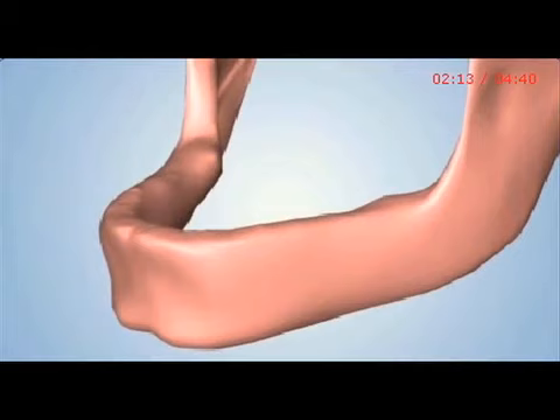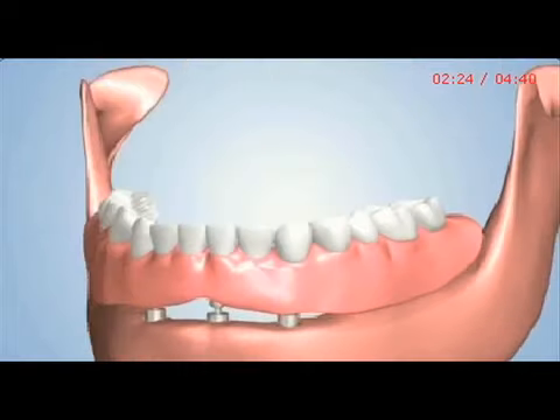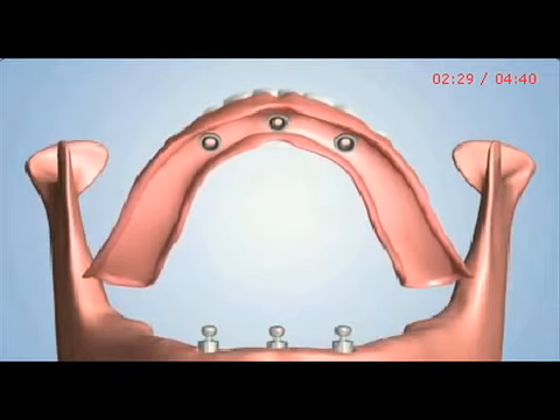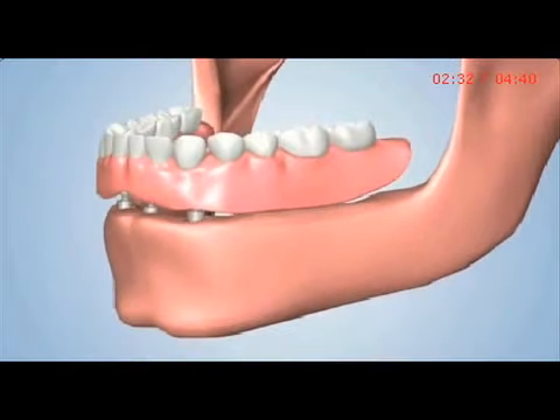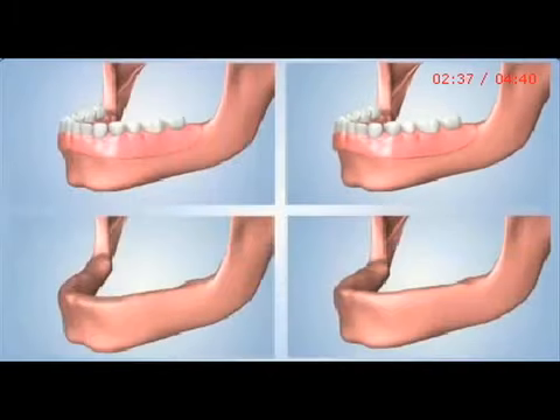A second option may involve the placement of two or three dental implants. Ball-shaped abutments are placed over the implants, and a customized denture is then designed to snap securely into place over the abutments. This is a connection type known as the ball and O-ring attachment. This denture can also be removed by the patient.